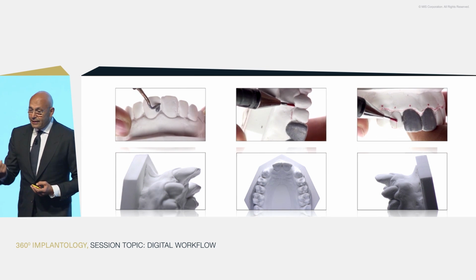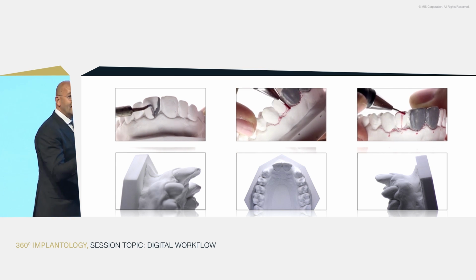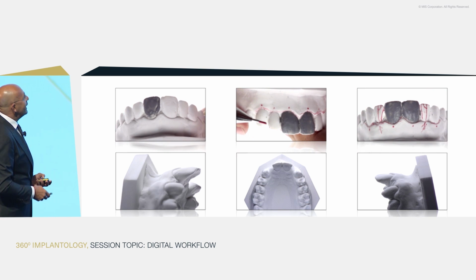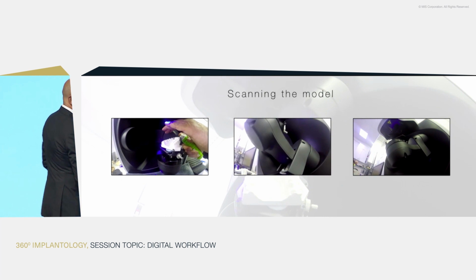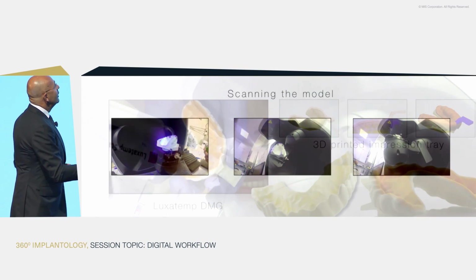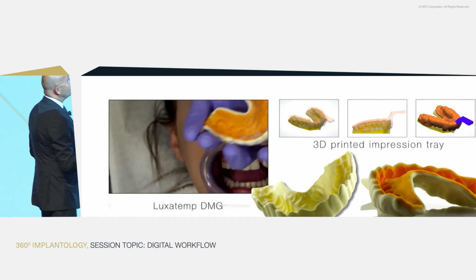So in the lab, we are designing the case with the wax up. Hilal is using my incisal edge position as a reference and then building up the rest with the wax. And after that stage, we immediately scan the model. Why? Just simple enough to print a 3D tray for us to make the impression. This is Luxatemp. We're loading it.